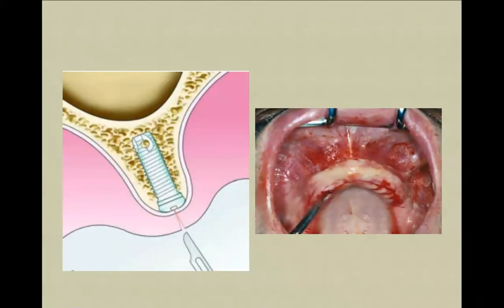Okay, now we did recheck. We did a checkup of the patient the day after. Again, the critical point for the mandible is numbness here. If there is no numbness, that's okay. On the maxilla, it might be related to the perforation of the sinus.